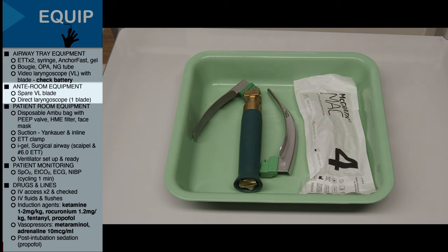Next will be the tray of equipment that will remain in the anteroom outside of the patient's actual room. This will be some backup airway equipment which can be made available at short notice should you require it, but doesn't necessarily need to be taken into the room. This will include a spare video laryngoscope blade and a direct laryngoscope.